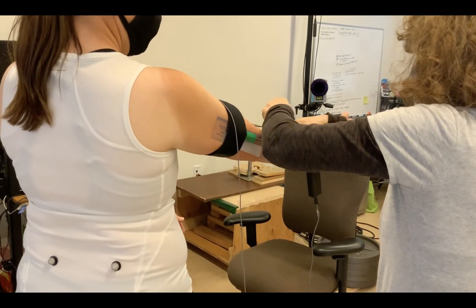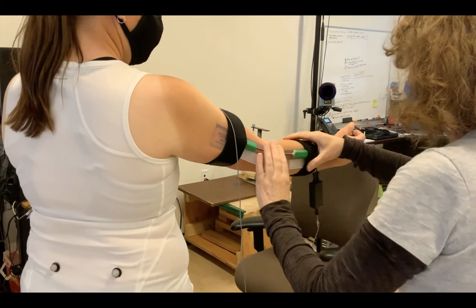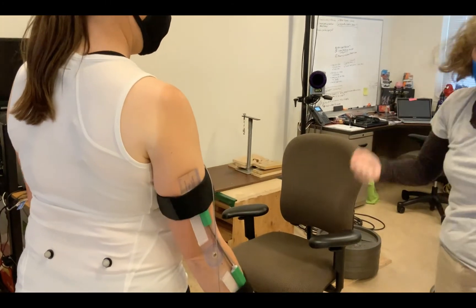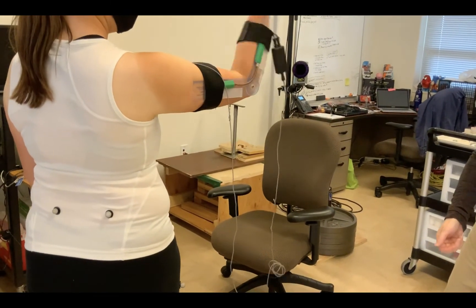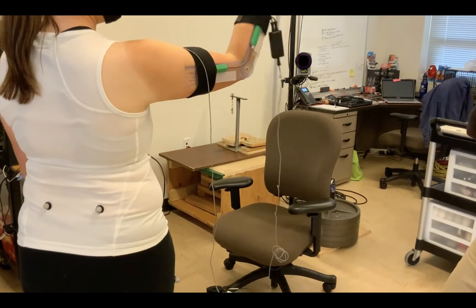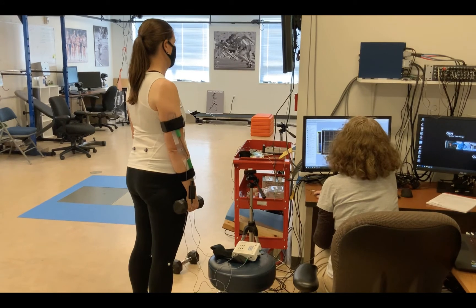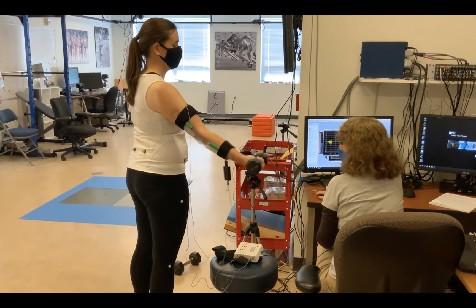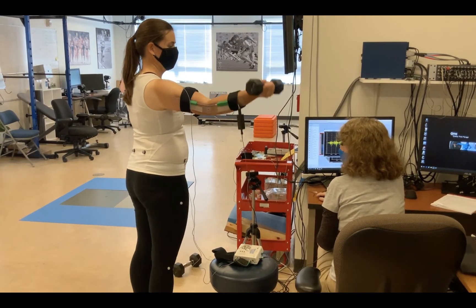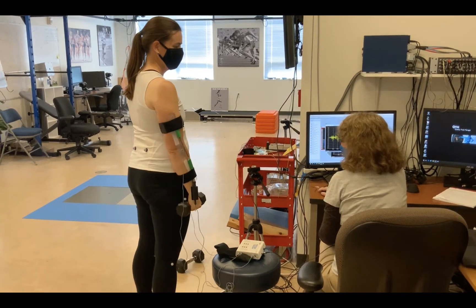And so this is an electrical goniometer—it's recording a voltage and that voltage corresponds to angles. You can see that it flexes there from 0 to 90 degrees as the subject does a contraction. Then you can give your subject a weight and you can have them do some contractions.